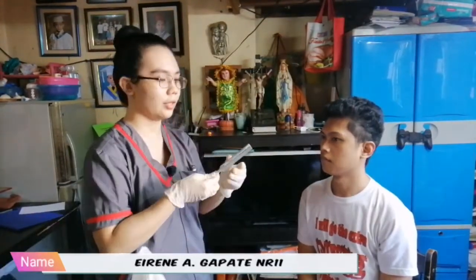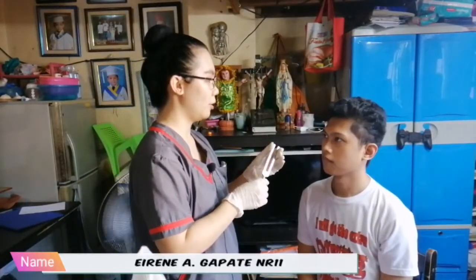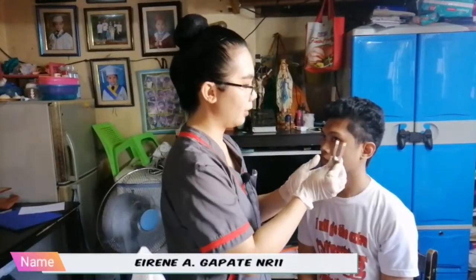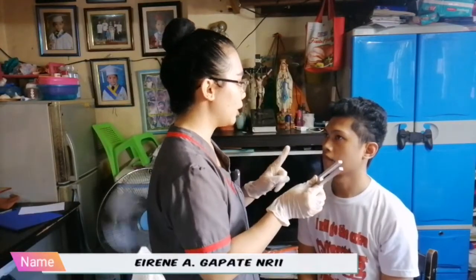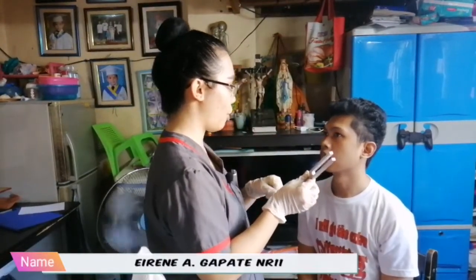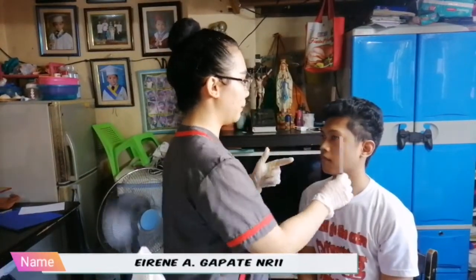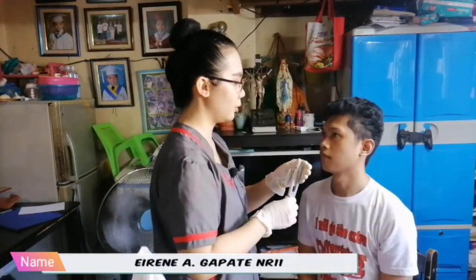So, ayun sir, tawag dito is tuning fork. Patutunugin ko to. Then, kapag napatunog ko to, ilalagay ko dito sa part ito, dito sa likod ng tenga nyo, sa buto. Tapos, if nag-stop na yung sound, pakitaas yung hintuturo, okay? Pagtapos nun, ito naman, itatapat ko sa tapat ng tenga nyo. Ganun din. Taas nyo rin yung hintuturo nyo.